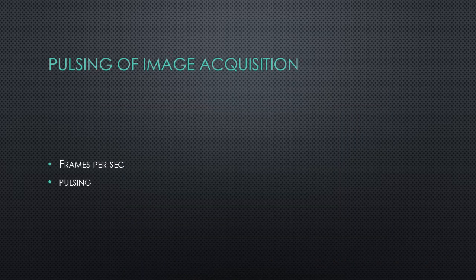So it's been mentioned that digital fluoroscopy acquires images in a frames per second mode. This is for a non-intensified system, one that uses a flat panel technology. The frames themselves can be thought of as many fast images that were acquired, almost like looking at a flip book when you're viewing the images. Pulsed fluoroscopy images are used with an image intensifier, and they turn the exposure on and off at a quick rate. This lowers dose as well.